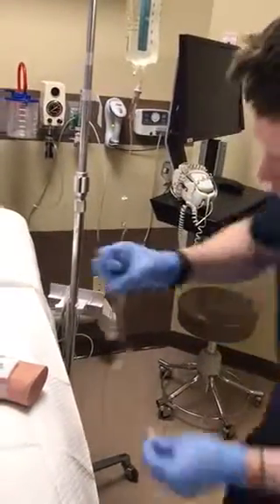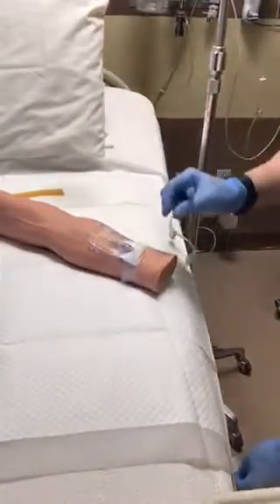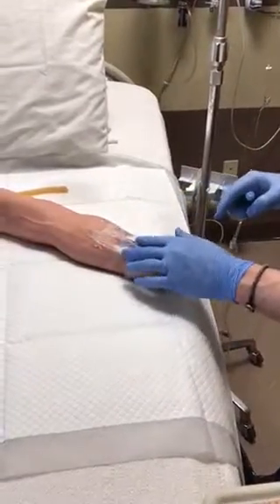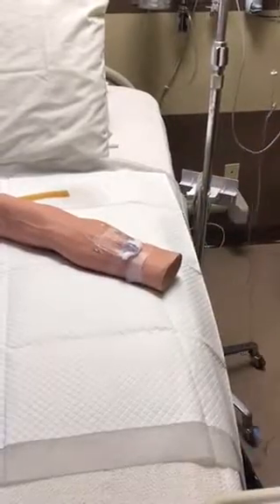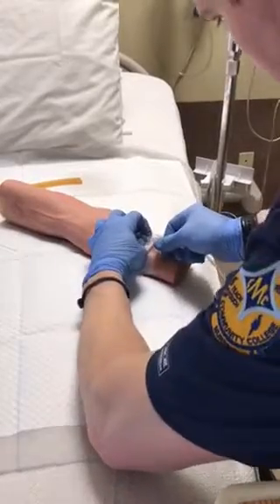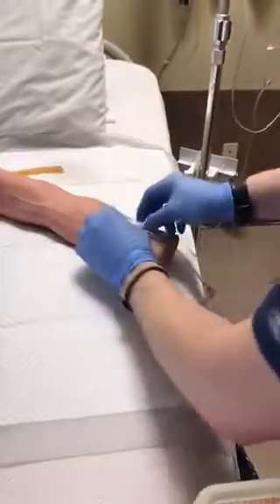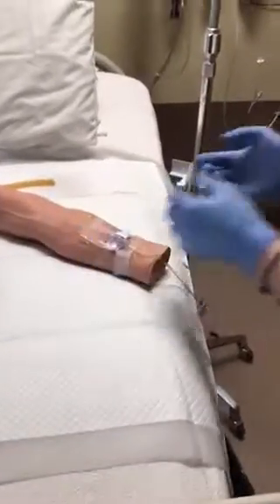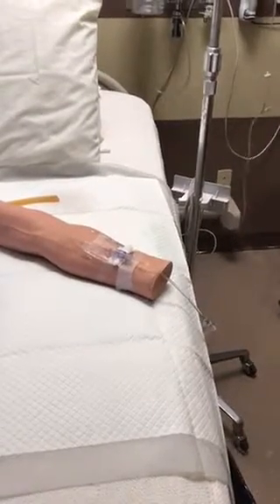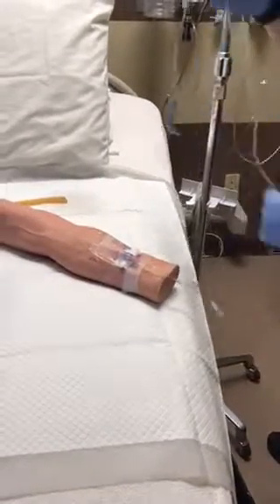Use an alcohol swab to cleanse the port here, and I'm going to let that dry for 30 to 45 seconds. Fast forward in time, 30 to 45 seconds. And connect that. Alright, so we used a 10-drop IV set, and I'm going to go ahead and prepare my site.